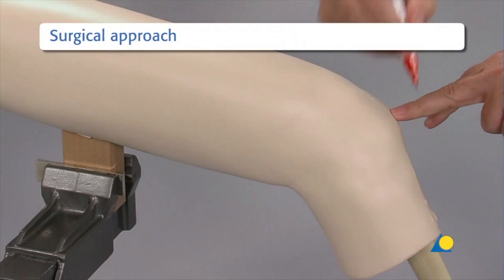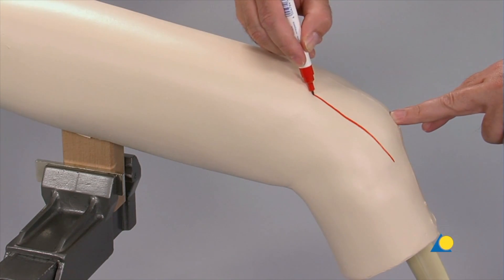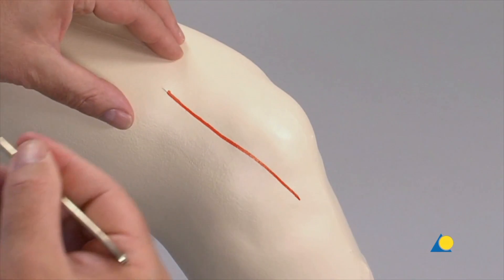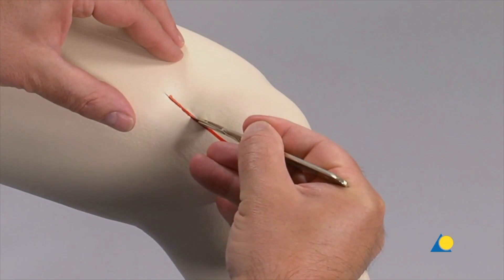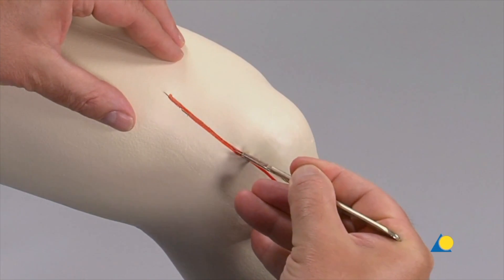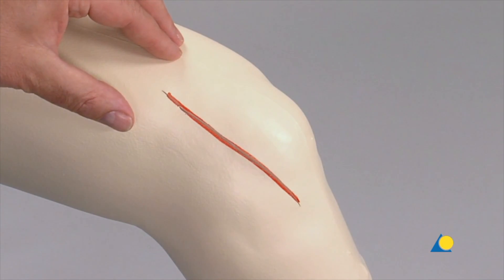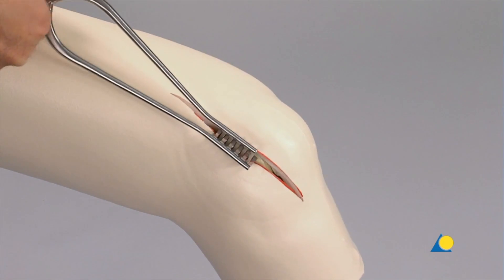In the presence of a complex intraarticular fracture, a 3-3-C2 or C3 fracture, a lateral parapatellar approach is made. An arthrotomy is performed to expose the joint for reduction. The patella is averted, and the incision is extended for adequate exposure of the joint for anatomical reduction and fixation. The soft tissue is held open with the spreader.